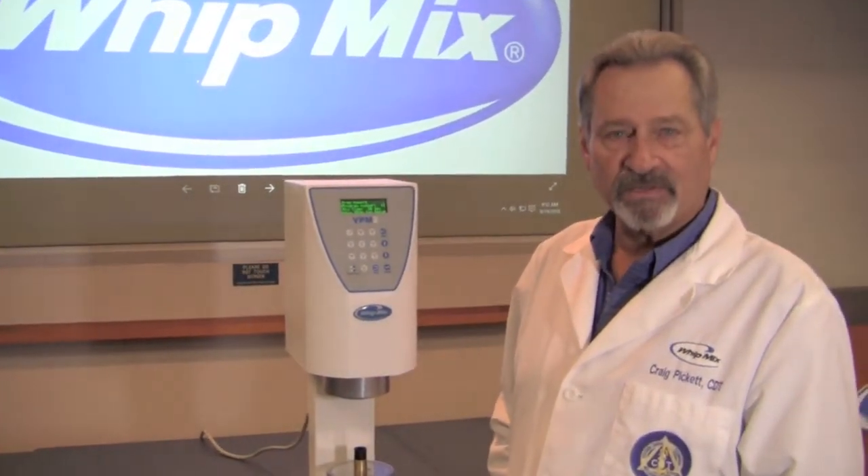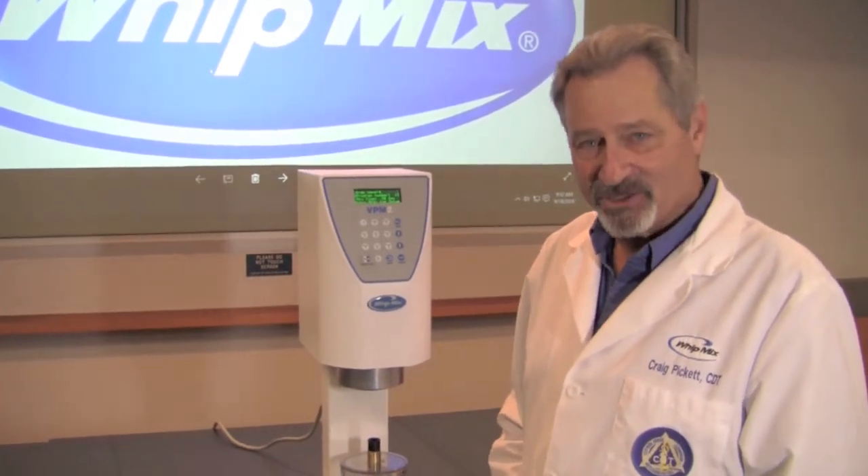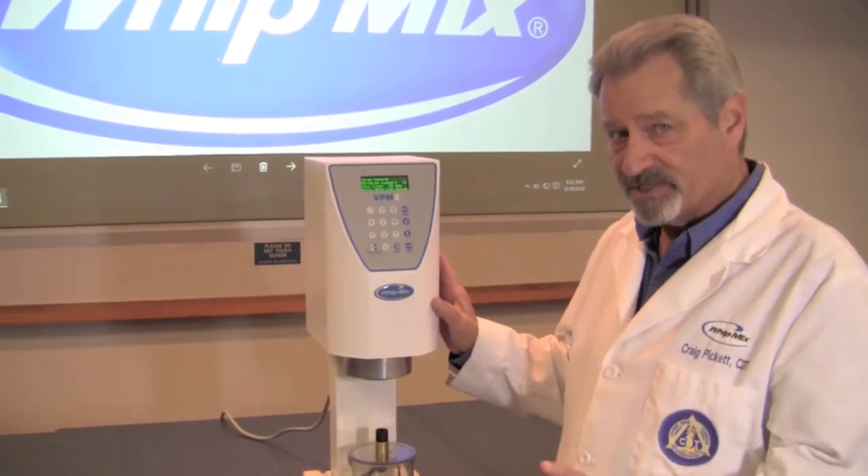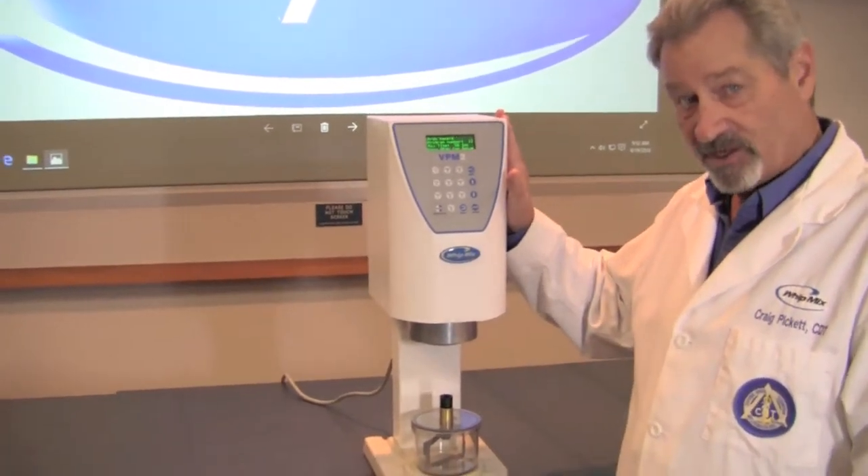Hello, I'm Craig Pickett. I'm the Technical Education Manager here at the Whip Mix Corporation and I want to talk to you just for a moment about a maintenance issue for the VPM2 vacuum mixer.